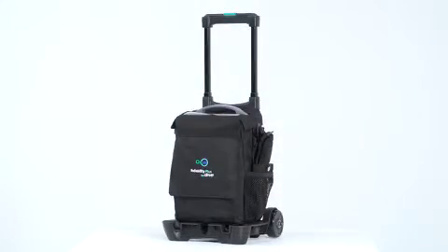It's one of the only units with a built-in dehumidifier, removing up to 80% of the air humidity, which is critical to protecting the internal components of an oxygen concentrator.